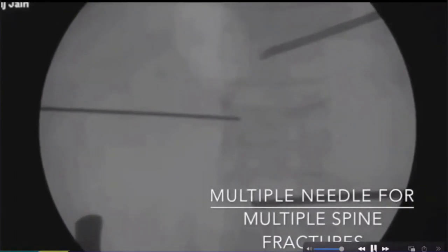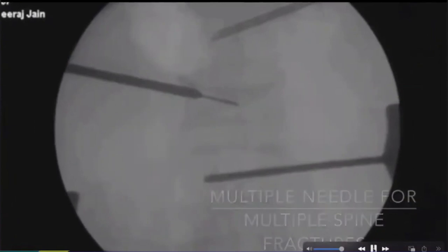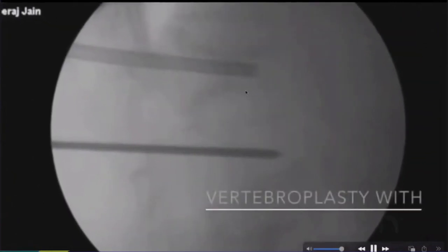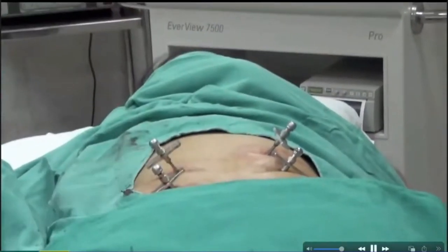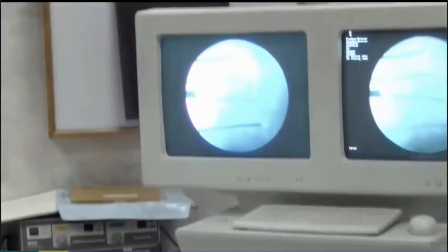Yes, this is how we put a KVAR, or this is a patient who needs a vertebroplasty and kyphoplasty. Now this is a kyphon needle going. There's a collapse. If there's a collapse, you might have to put a kyphon balloon. So you can choose to do that. What is required for a given vertebra, you select and go accordingly.